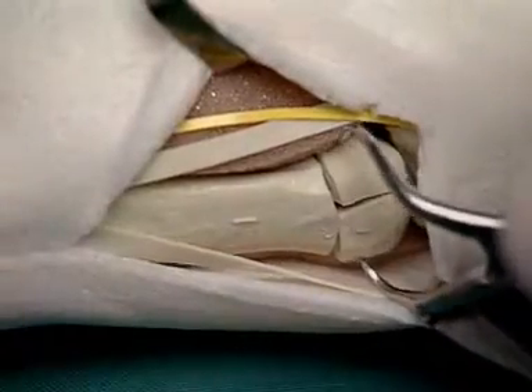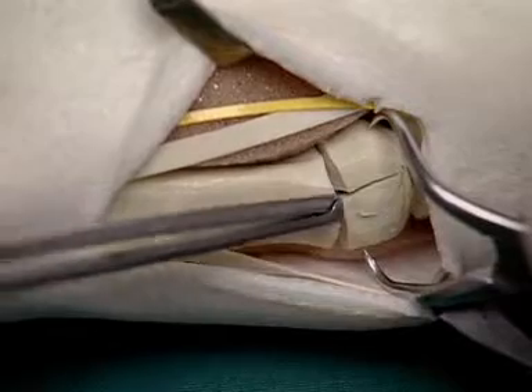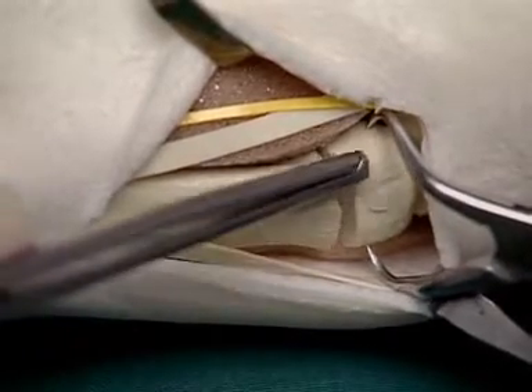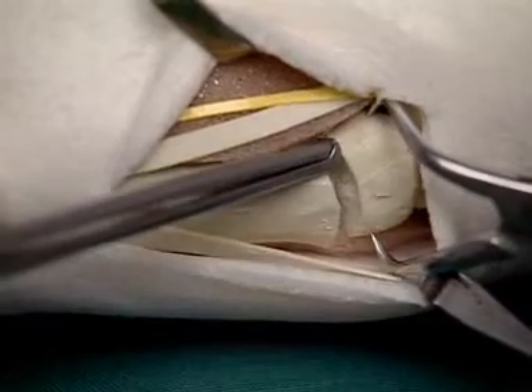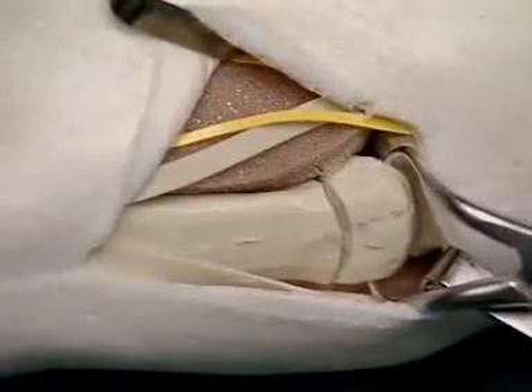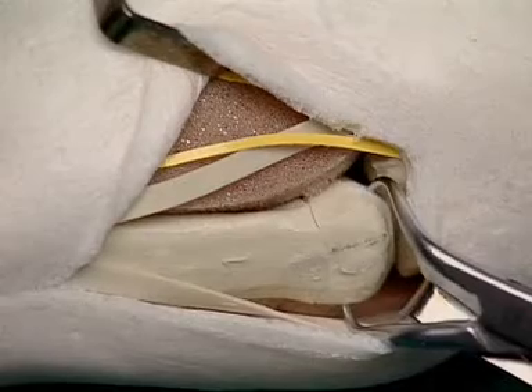First, the exposed joint fragments are reduced and stabilized with the reduction forceps. In this way, the reconstructed joint can then be reduced to the shaft of the metacarpal bone.